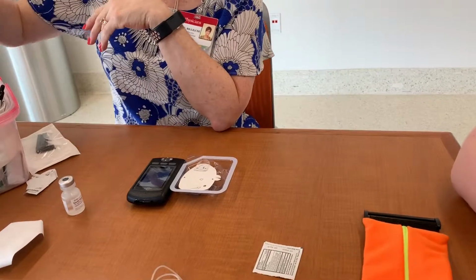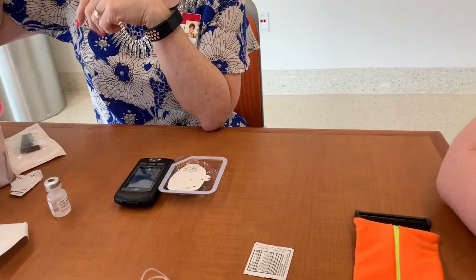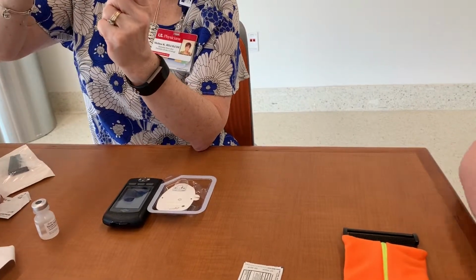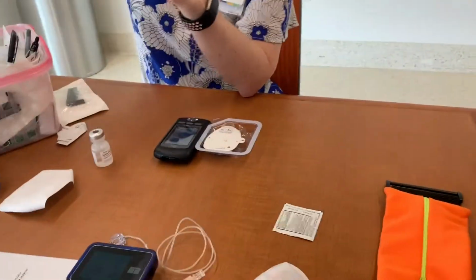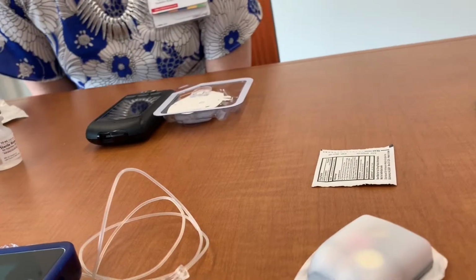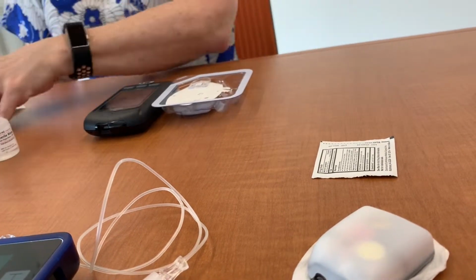So do you have a sharps container that you put your needles in? Yes. So just the needle part would go in sharps, and then this can go in your trash. And I have a sharps container back by my desk, so I'm gonna take that. So you hear it? Yeah. So it's getting rid of bubbles and making sure everything's good.